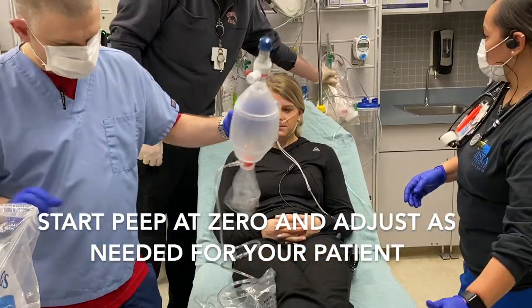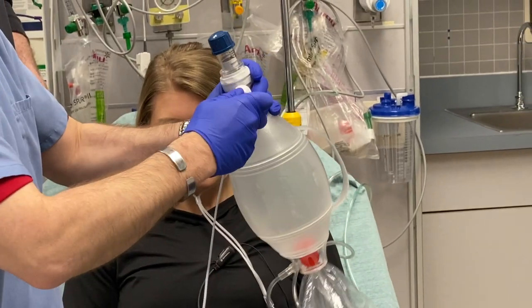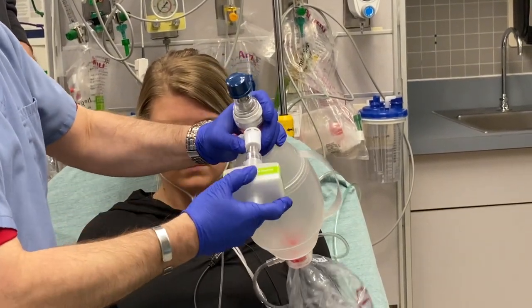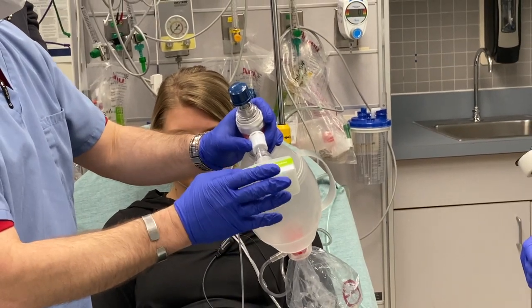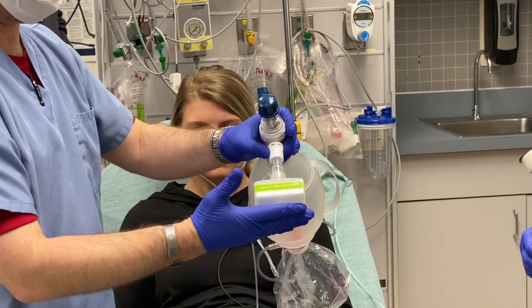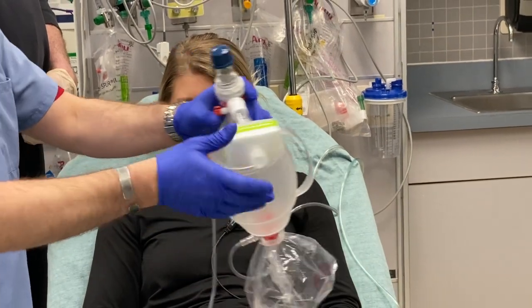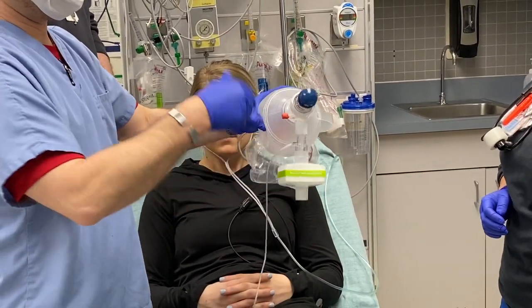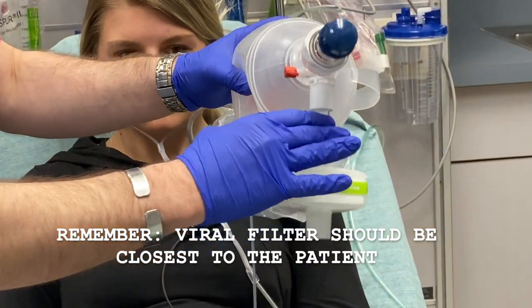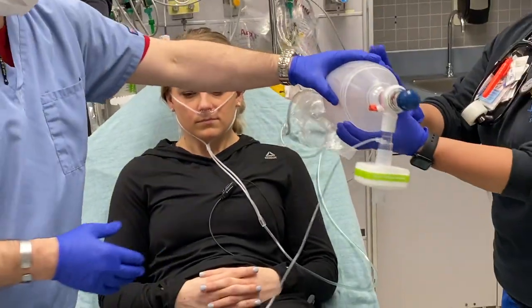You want to make sure that you have, hold this, we'll put your end-tidal CO2 there first, because the filter should be closest to where the patient is. So anything that goes into the filter goes directly from the patient. Okay? So now what we have is our BVM, PEEP valve, end-tidal CO2 detector, waveform capnography, I should say, and then we have our viral filter. Okay? Just hold on to that.